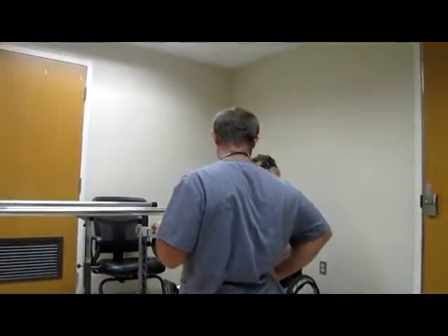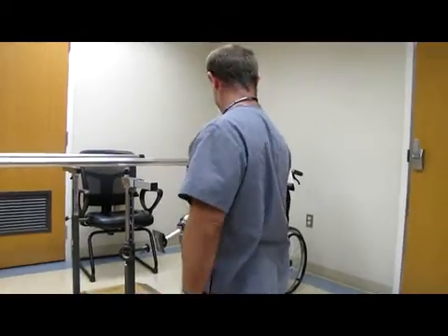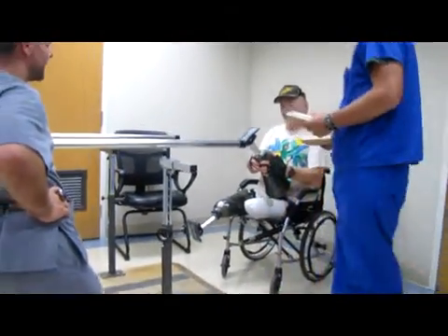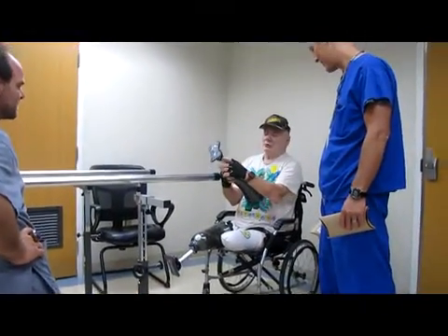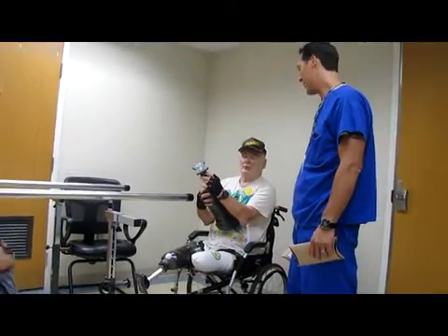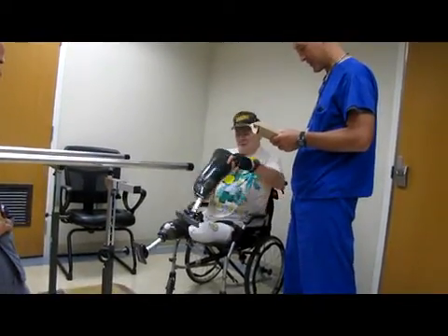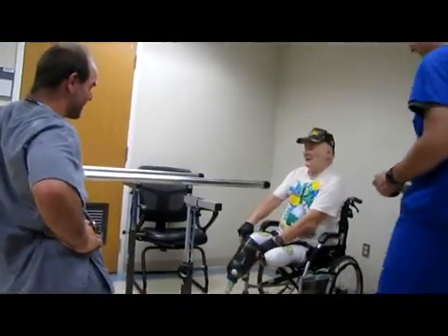Actually, I got some special socks for you, Ron, too, rather than the shrinkers. Sure. They look cool though. I know, they do. Looking really good. I accessed them on the web and I'd like to look at the feet specifically. Yeah, and the elasto things here. I thought maybe this one was pressurized like a shock absorber, but it isn't. It's rubber also. It's like that little dial controls a pre-tension. But it's neat, it's high tech, and I'll be the only one on the block. That's right. Probably within my district.